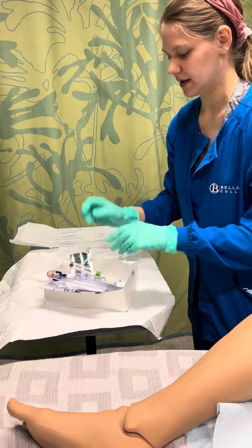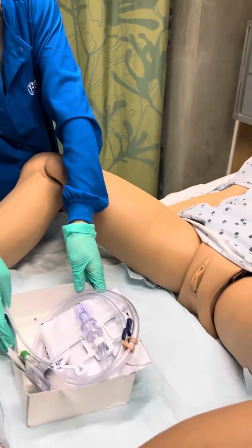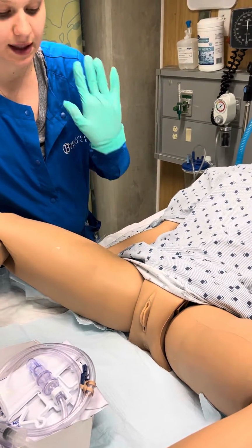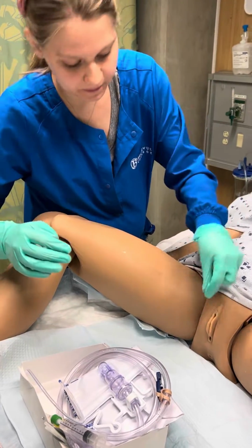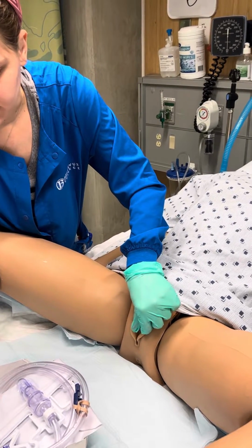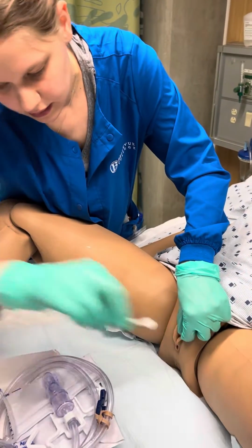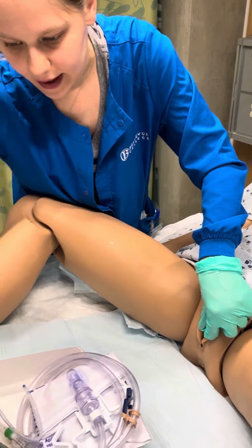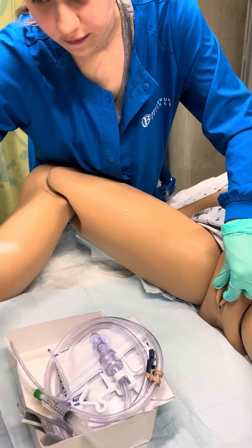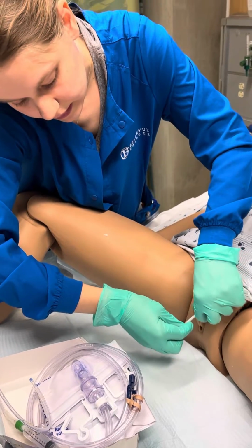Right, so everything in here is sterile. I'm going to move my sterile box over to my patient. All right, and I'm just going to touch your perineal area, okay, and I'm going to clean it up. I'm going to take my non-dominant hand and it's going to become non-sterile as I spread the patient's labia. And I'm going to clean with one swab on one side, from front to back, and on the other side, front to back, and down the center, around the urethral meatus.